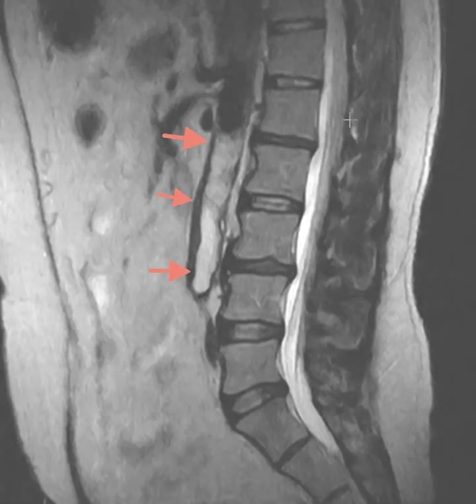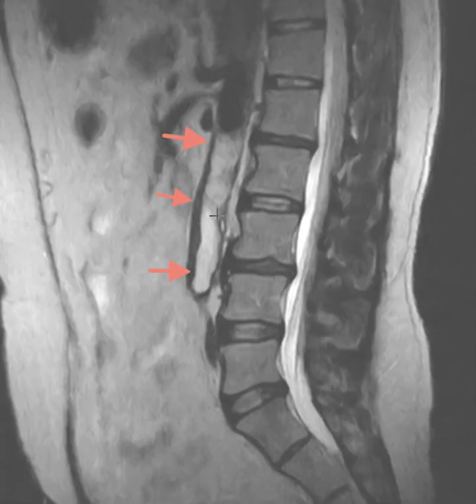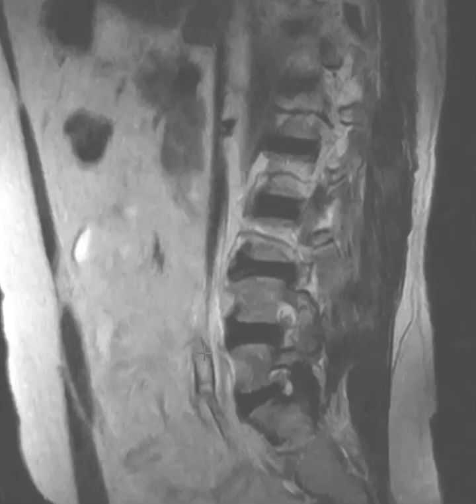This is abnormal. Normally flowing blood will be dark. Anything moving will be dark. So we have a blood vessel here that's dark. The upper aorta is dark. And right here on down is thrombus. So, lack of the normal flow void. So he has a big cast-like thrombus filling the abdominal aorta, going down into the iliac arteries.